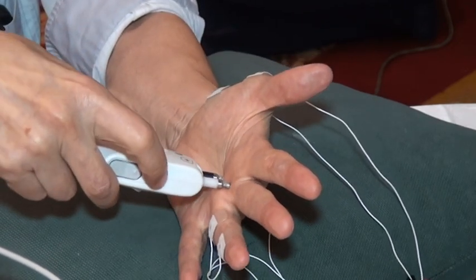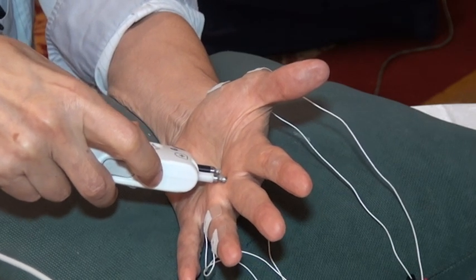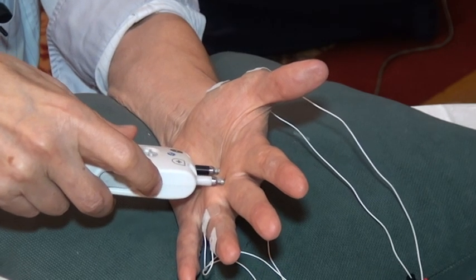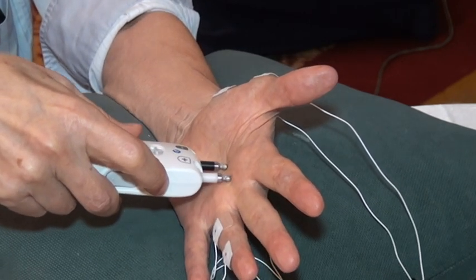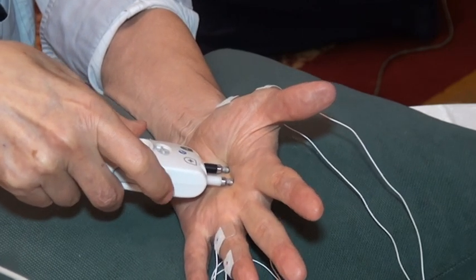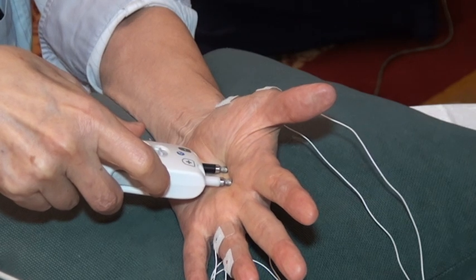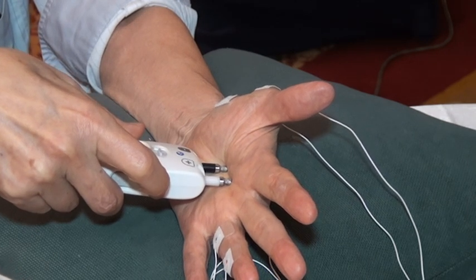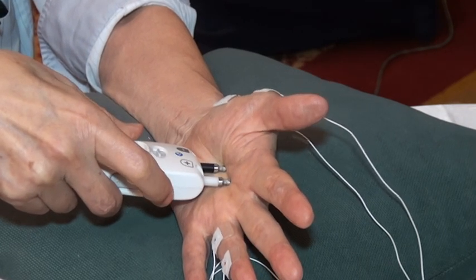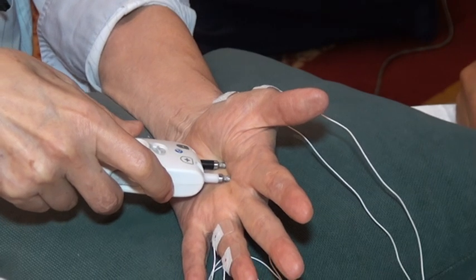I'm not used to this. I stimulated, I felt it, and so the shock is gone, but nothing happened. No movement. Okay, now I go more proximally around here. You see the movement? You don't see movement because you are not looking at the video camera. Let's see it again. What is the movement?